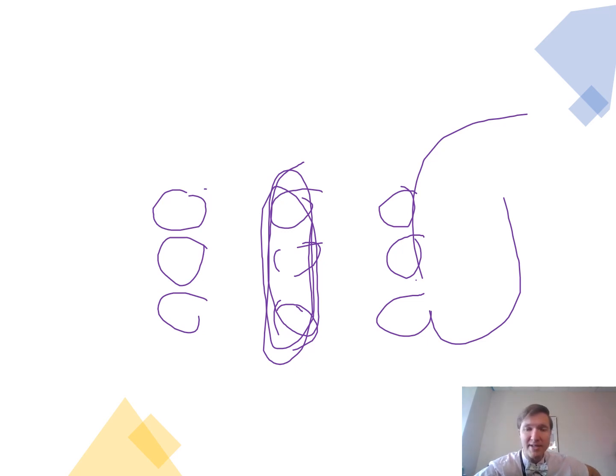Could be bronchospasm, kinked tube, and so on and so forth, right? So we need to make sure to troubleshoot this. And this is all to give you a pattern. The way that I remember it is if it's a Raw or compliant relationship, if it's compliant, PIP and plateau hold hands. They both increase or decrease together. Their PTA stays the same. Their distance is always the same. But if one stays where it's at and the other one leaves, changes significantly, then it's a Raw relationship.